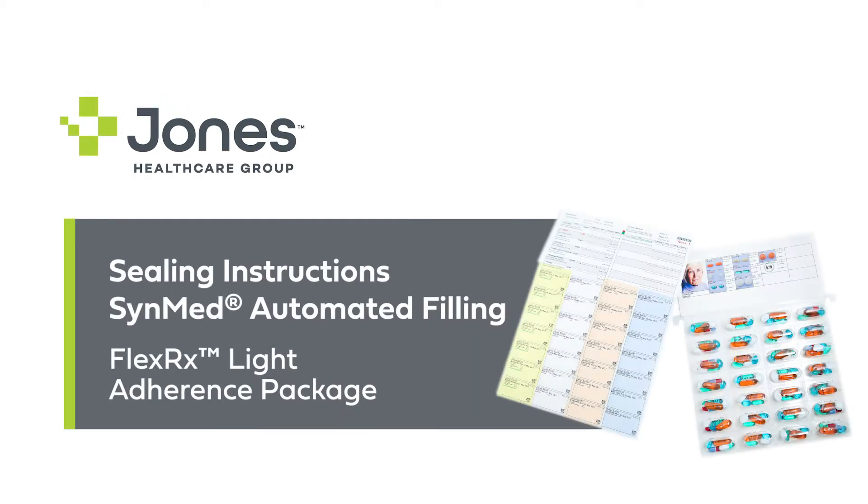Welcome to Jones Healthcare. In this series of videos we provide step-by-step instruction on how to assemble our range of adherence packaging. Today we will review how to assemble and seal our FlexRx Light adherence package using SynMed automated workflow solutions.